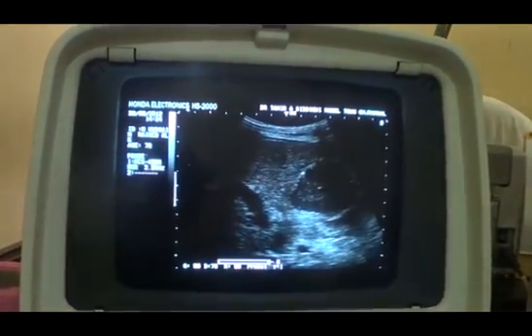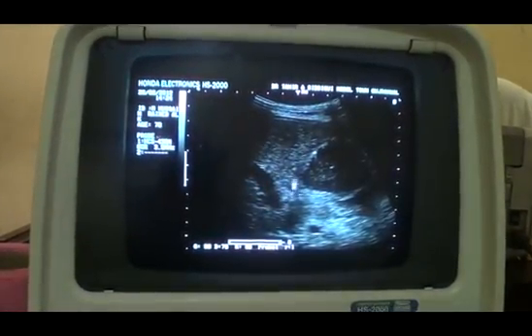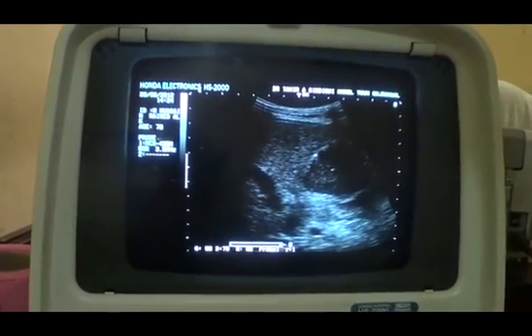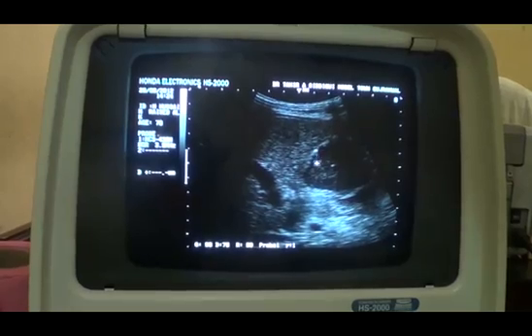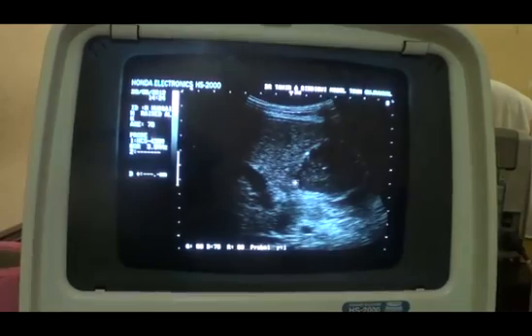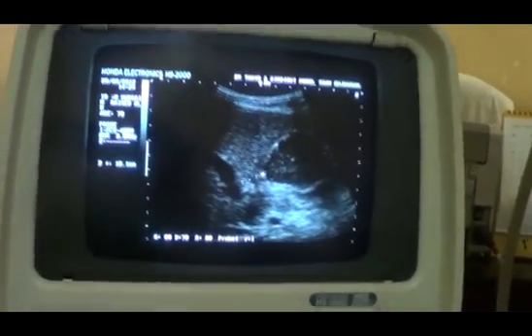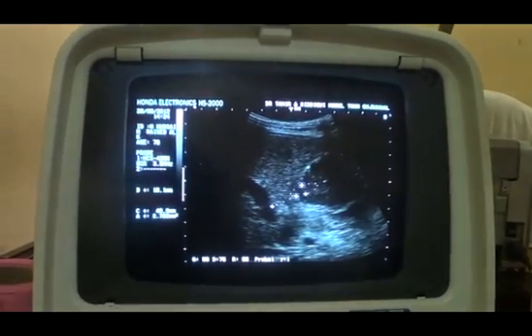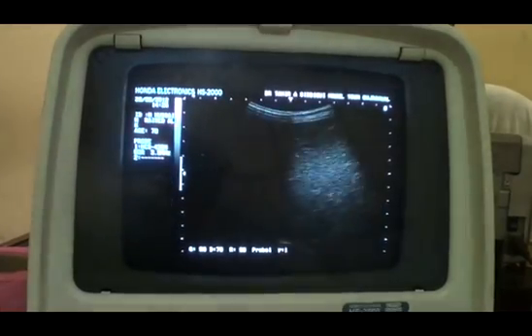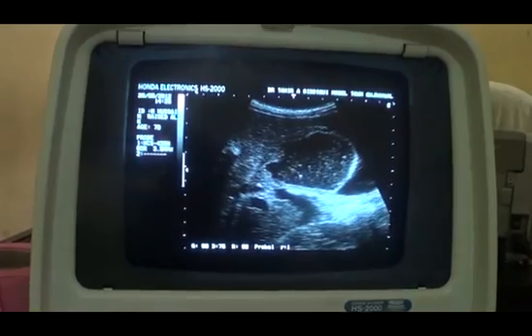and here you see that this is the portal vein, this is the gallbladder with, now these are cholesterol calculi. Note the comet tail artifact. This is the gallbladder, this is the portal vein, and it is at right angle to the neck of the gallbladder. This is the neck of the gallbladder, this area. So we are seeing the gallbladder, no question about that. We are right in this sense.